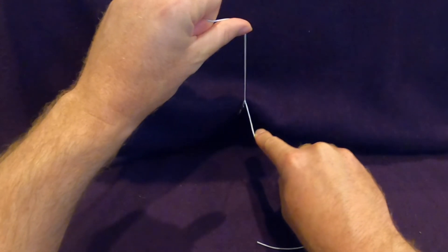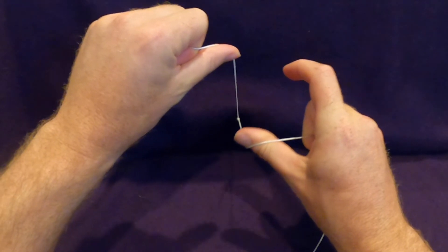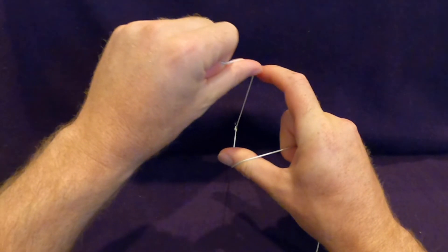As we prepare for the second half of the knot, watch the thumb as it pushes the suture along the fingernail. This creates a C and has the suture in the perfect position to begin the second half of the knot.